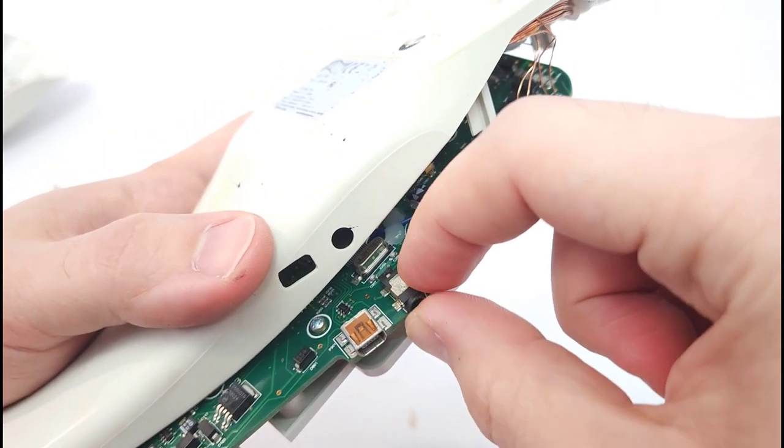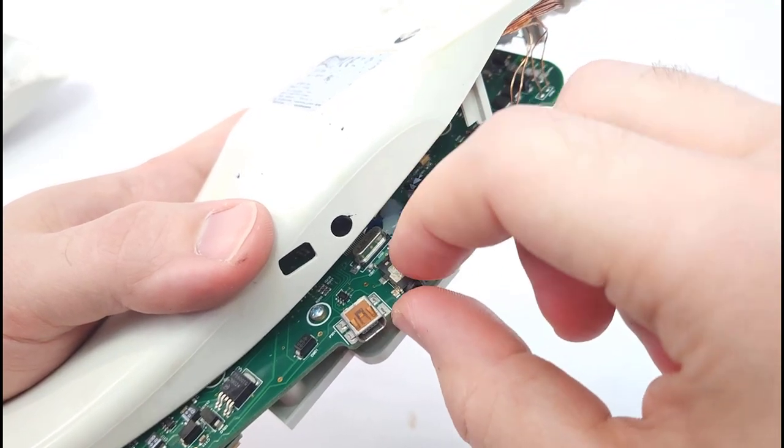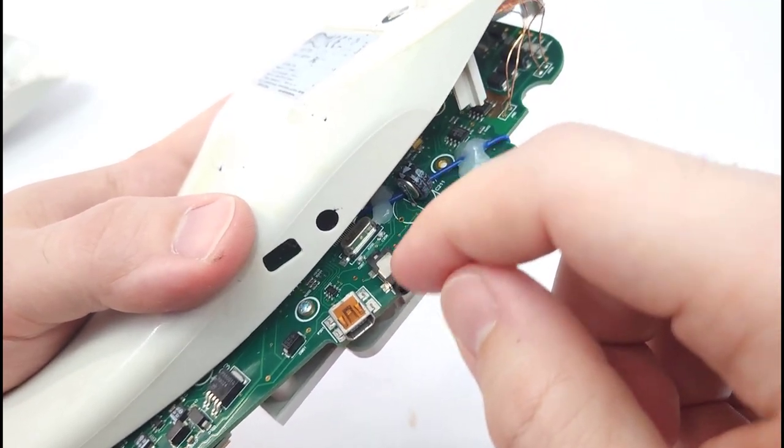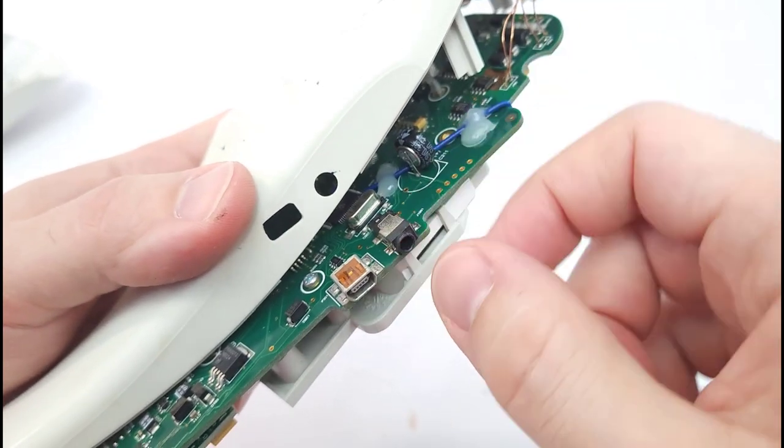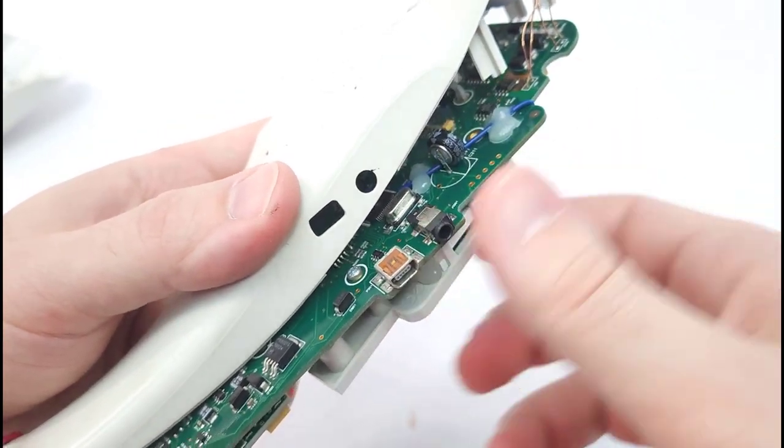So I guess the rattling noise is one thing. If it is not charging, that is another thing to look at, the fatigue on this port. And then again, maybe getting in there and adding some hot glue or something to reinforce that a little bit so it doesn't just break again eventually.